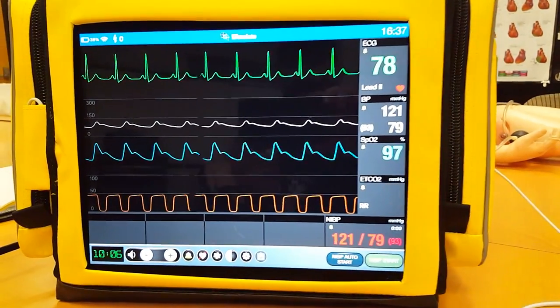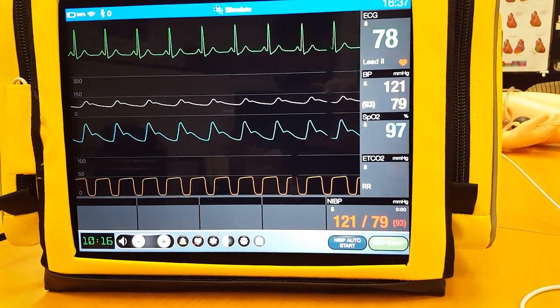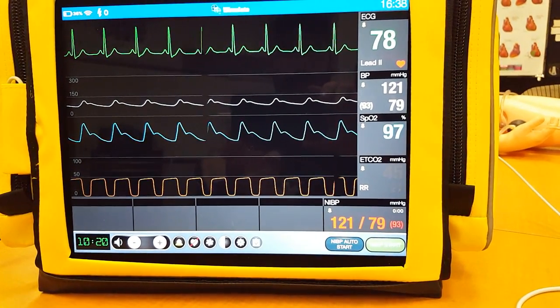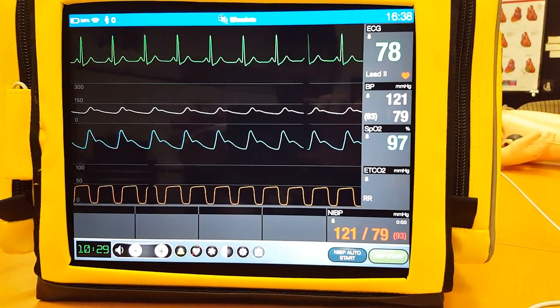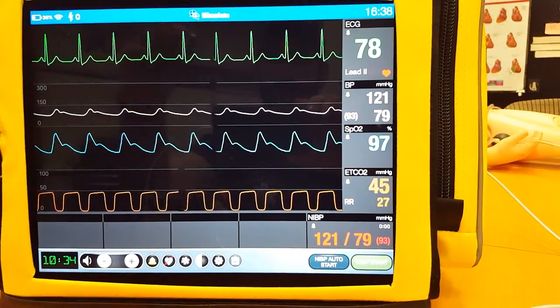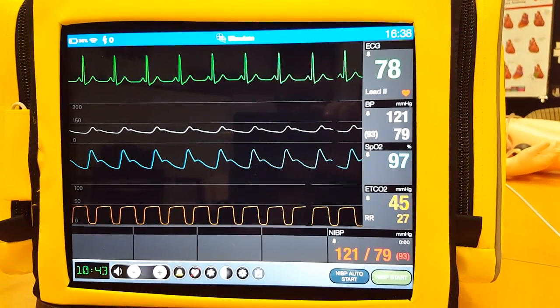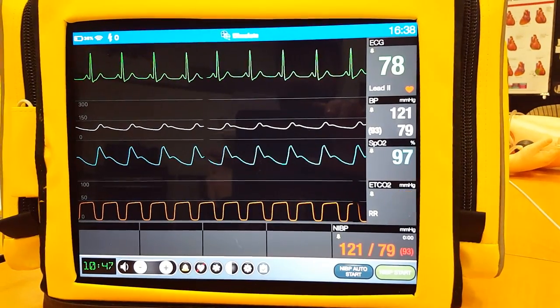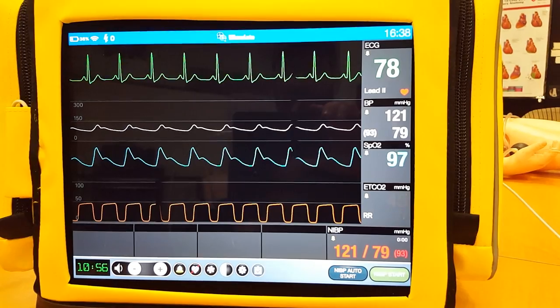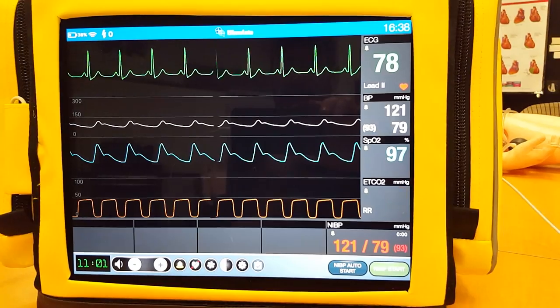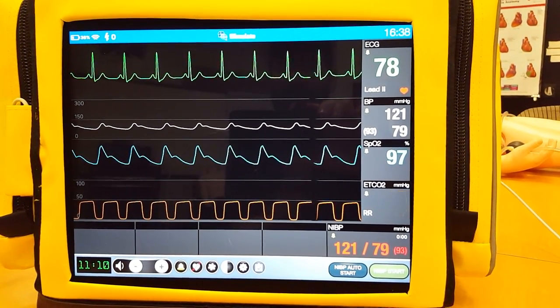Looking at the screen, we have the ECG waveform on top, the SPO2 or PLETH waveform in the middle in blue, and the end tidal CO2 waveform at the bottom. Our capnography gives us a little graph — as opposed to capnometry, which is just the number. If you go down from the ECG to the PLETH to the end tidal, the high points match up pretty nicely. The body's humming along: the heart is beating and squirting blood to the fingertips, the respiratory cycle is basically powered by that perfusion, so things match up graphically. When we start to see things get out of phase on these different waveforms, there may be a problem to investigate.